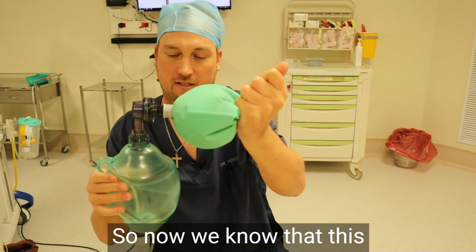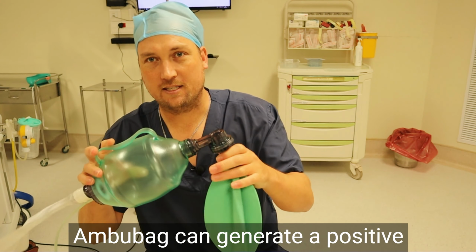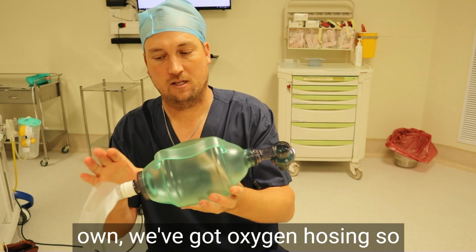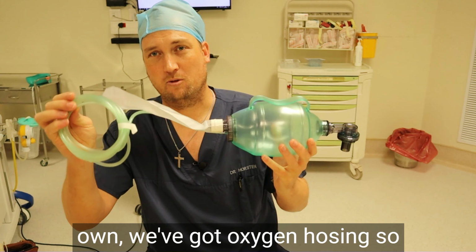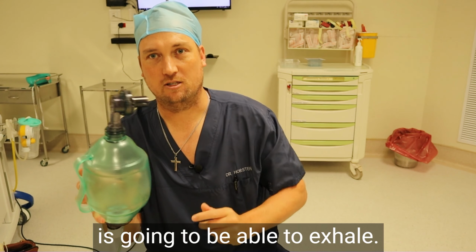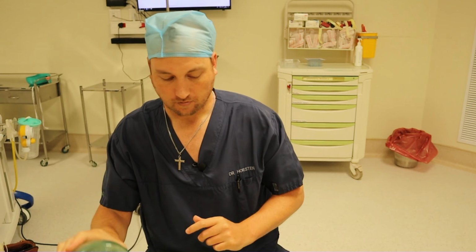So now we know that this ambu bag can generate a positive pressure. It can reinflate on its own. We've got oxygen hosing, so we can add extra oxygen if we need it. And then also the patient is going to be able to exhale.